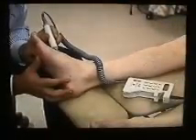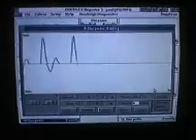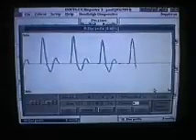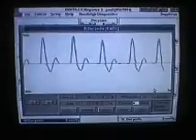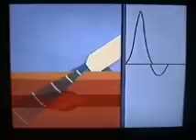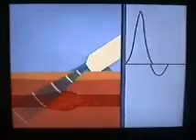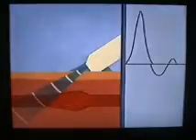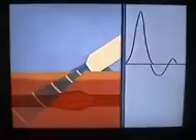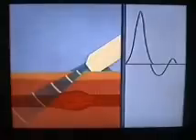This is a characteristic normal arterial waveform in the lower limb. The waveform depicts events in an artery during systole. The Doppler probe detects the initial forward rush of blood from the heart, then some reverse flow caused by the elastic recoil of the artery wall, and a final forward flow as the vessel has relaxed. This is the typical triphasic signal detected by the Doppler.